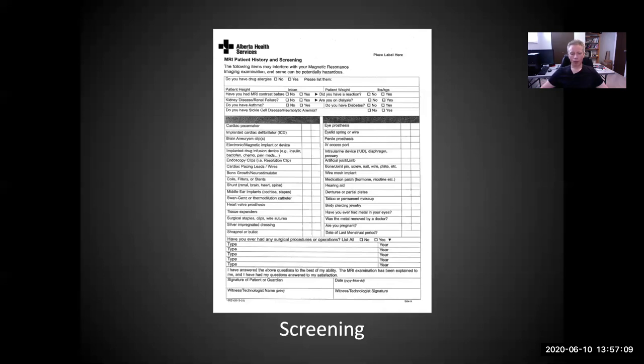Okay, finally the signatures. Bottom of the signature page, we want to see the signature of the responsible consenting adult. So obviously for children, this would be the guardian or parent. And if it is a responsible minor, in other words, one which is considered to be of age, which is discussed in more detail in the care handbook, then they can sign for themselves.